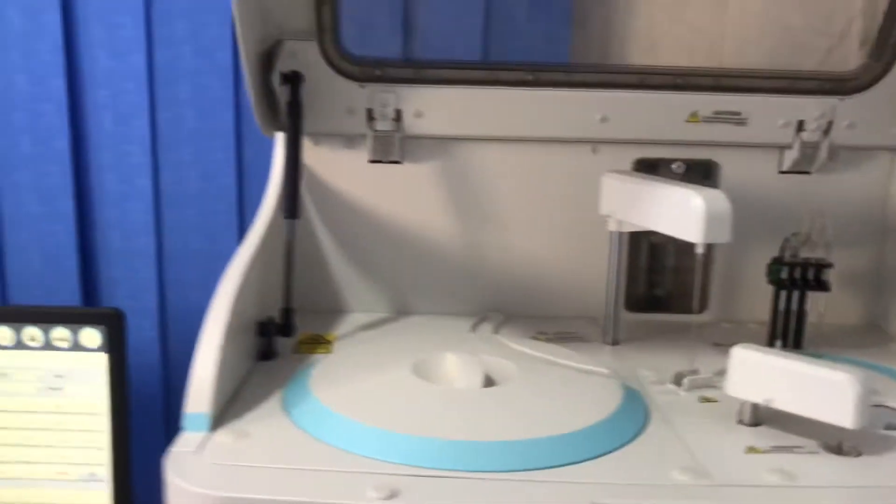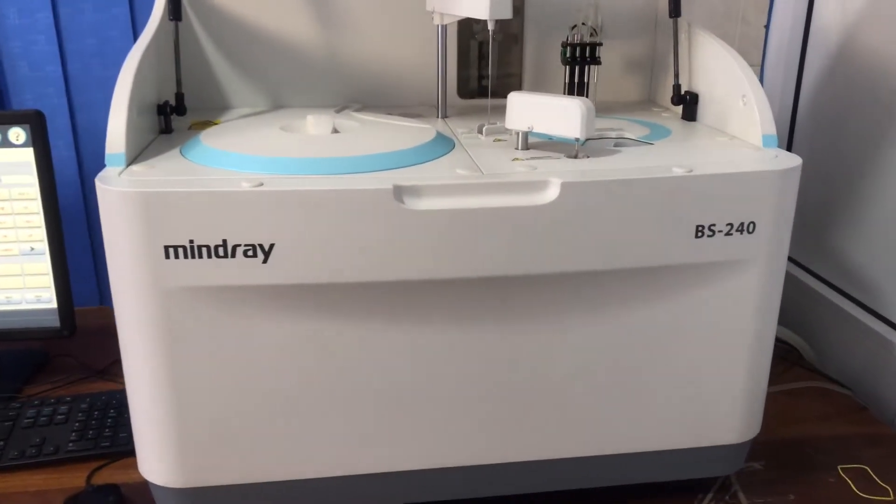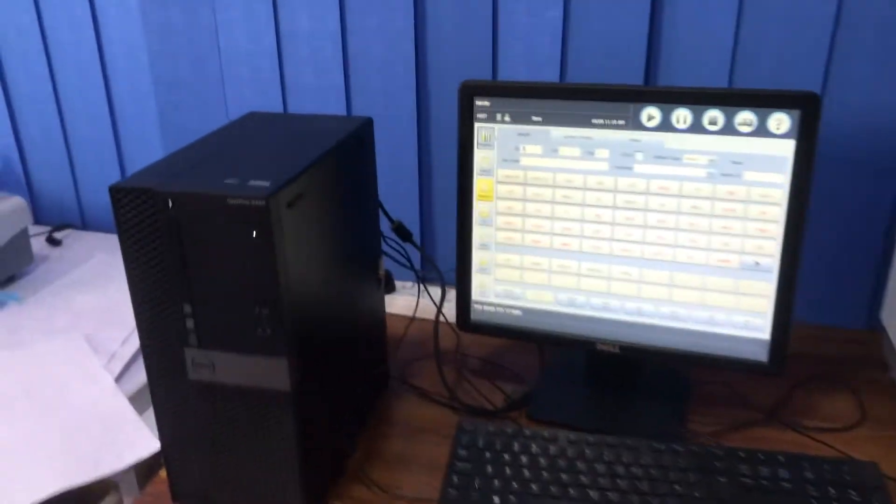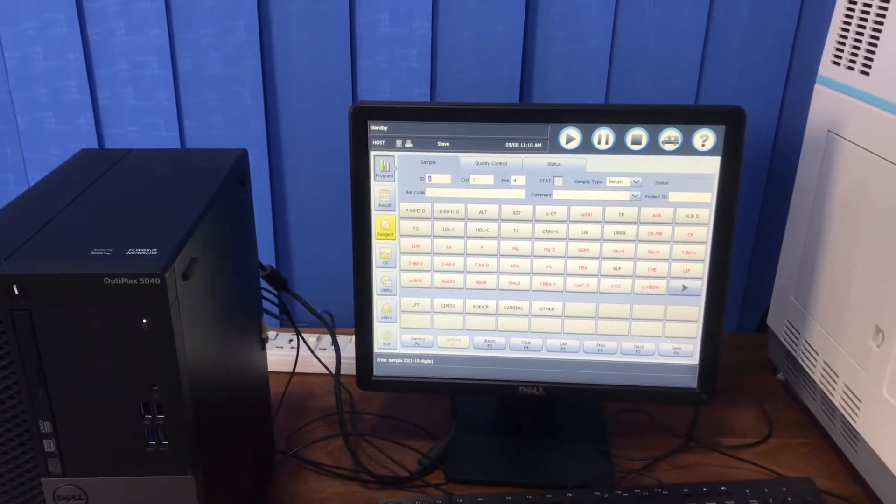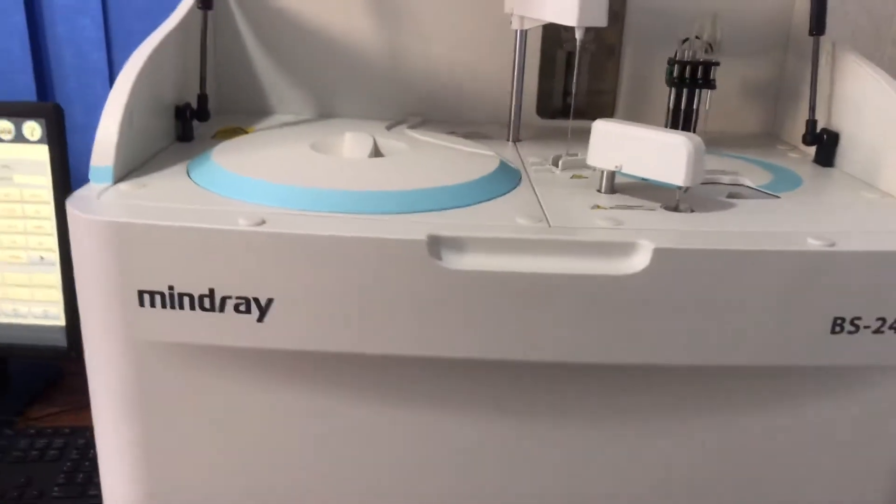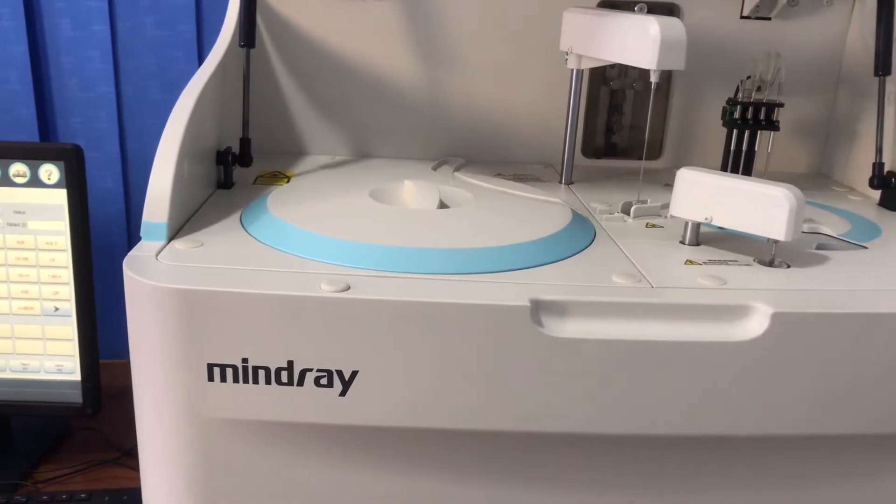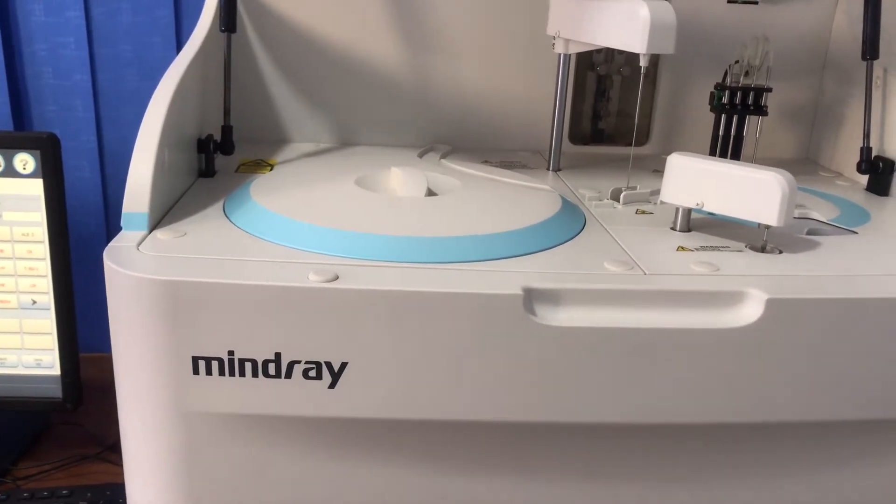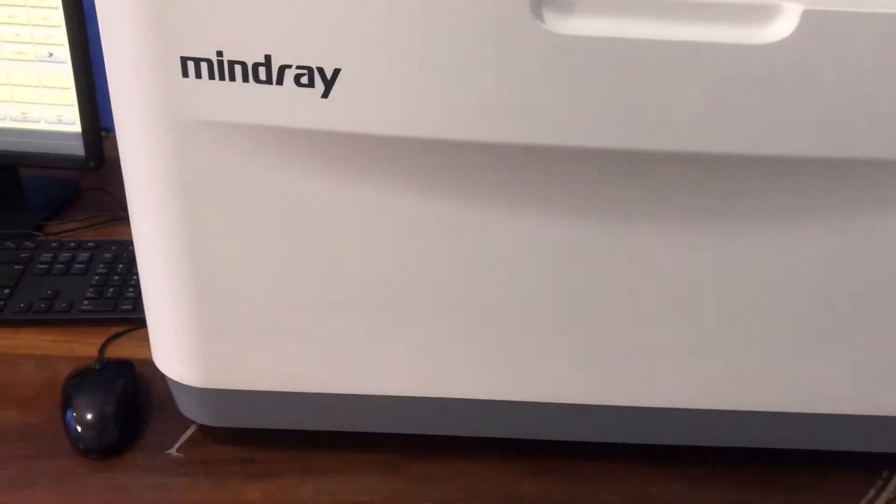What you see on your screen now is the analyzing unit and this is the operating unit. As I already mentioned, in this video our focus will be on the various parts of this analyzer and then how it functions. But before that, take a good look at the machine.